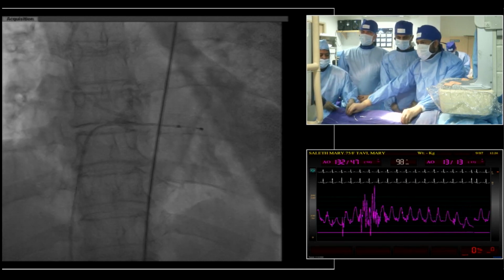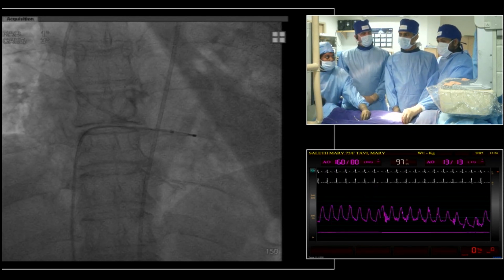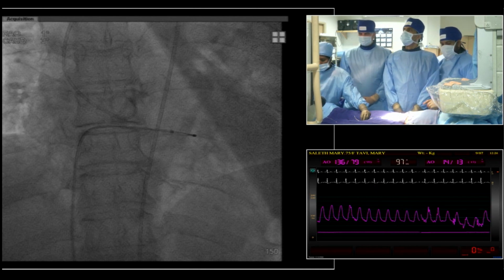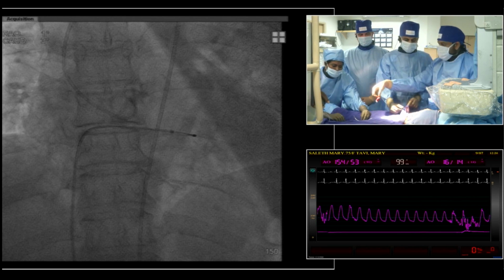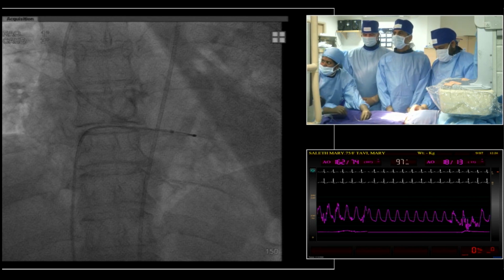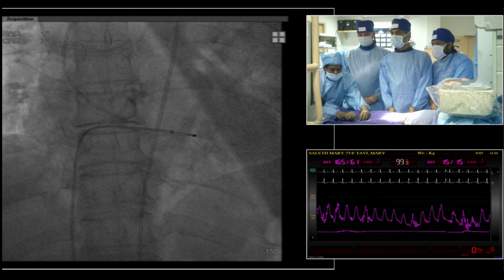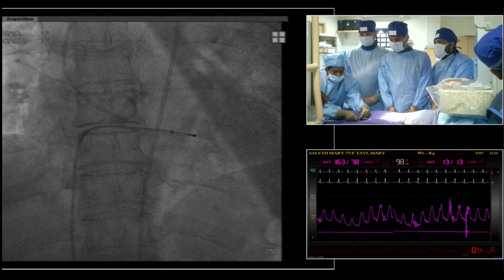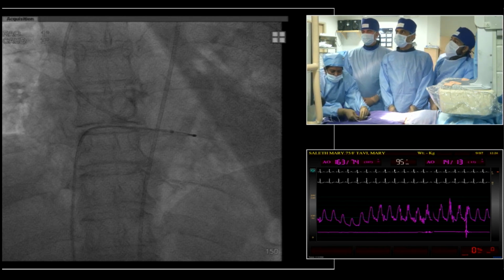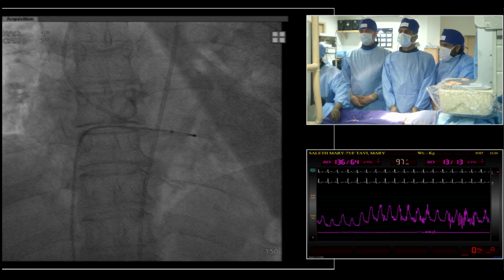So we've already got some information from an earlier aortogram and perhaps from the CT about the optimal projection angle. Yes, we have an angulation from the CT, but often we see that some minor modifications are required when we use fluoroscopy. The CT angulation was a bit different. In fluoroscopy, we have an AP with 4 caudal. So that's what we want to do now. Plain AP with 5 caudal. Yeah, 5 caudal.